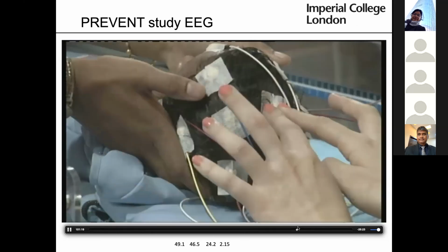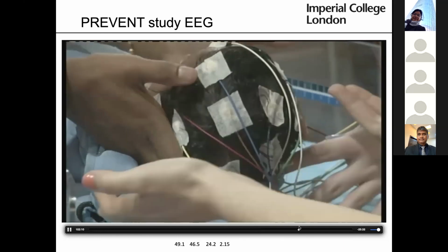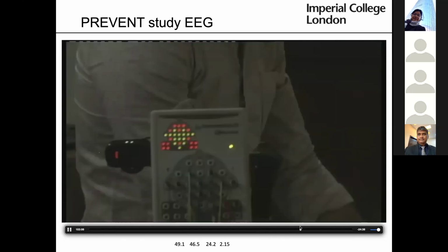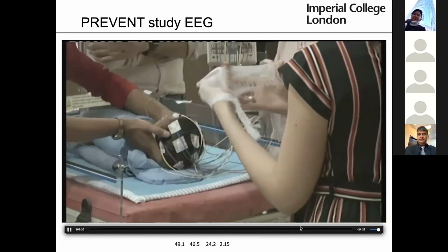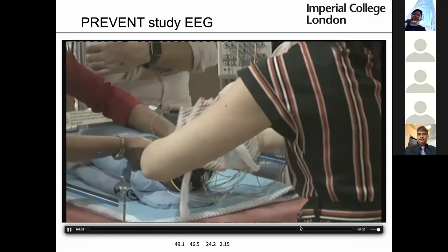And then once you got all the electrodes now, all the electrodes are fixed. Now you need to put the cap on, otherwise the electrodes will not stay in place properly. This is how you do that. Hold at the front, or you can just use gauze. Try and put this straight down.